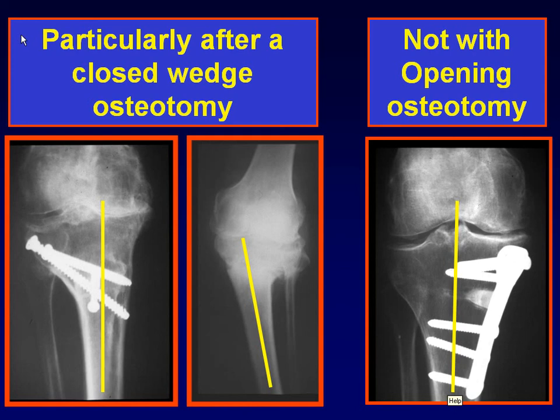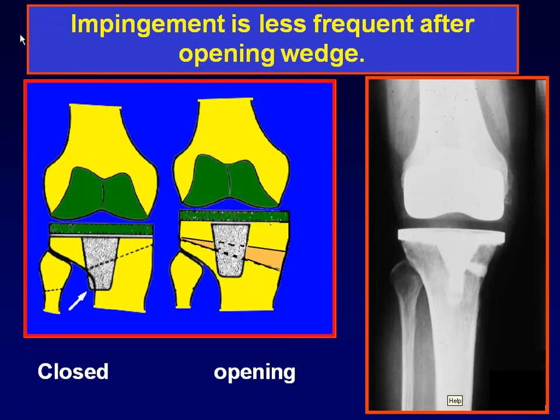I will say I have performed a lot of osteotomies for more than 30 years with opening wedge. But the main advantage of an opening wedge osteotomy is clearly for the total knee arthroplasty later. I know the closed wedge also, and I have nothing against it, but keep in mind that most of the patients will later have an arthroplasty, and the main advantage for the arthroplasty is clearly the opening wedge technique.